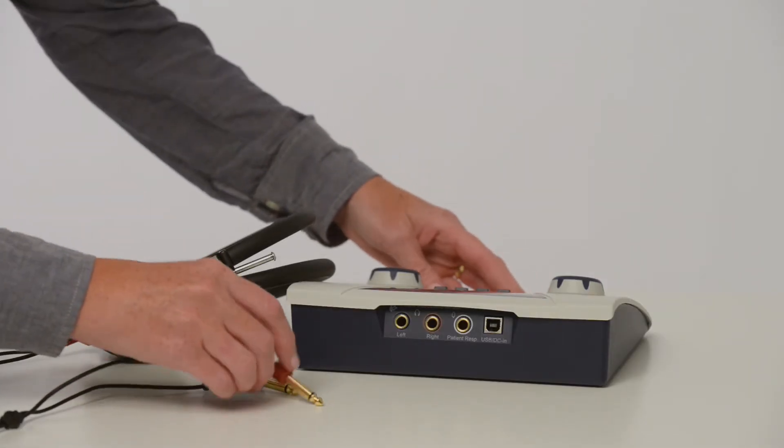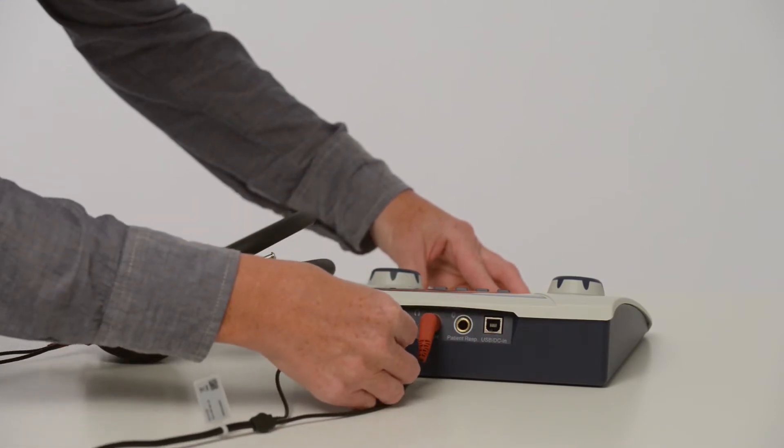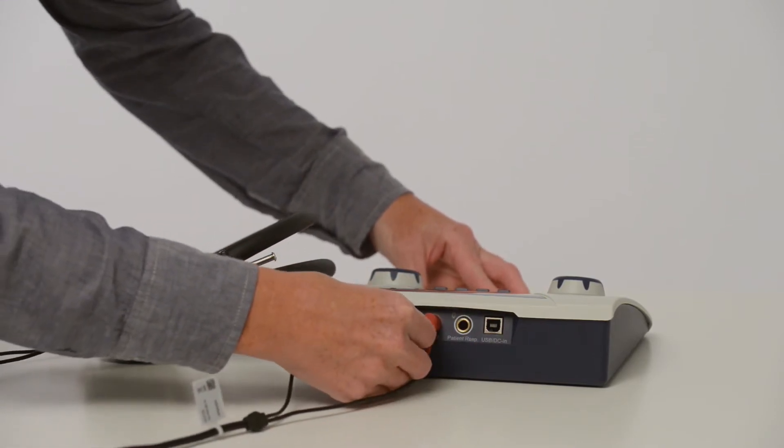Before using the device, plug in the headphones ensuring the red plug is inserted and fully seated into the red jack, and the blue plug is inserted and fully seated into the blue jack.